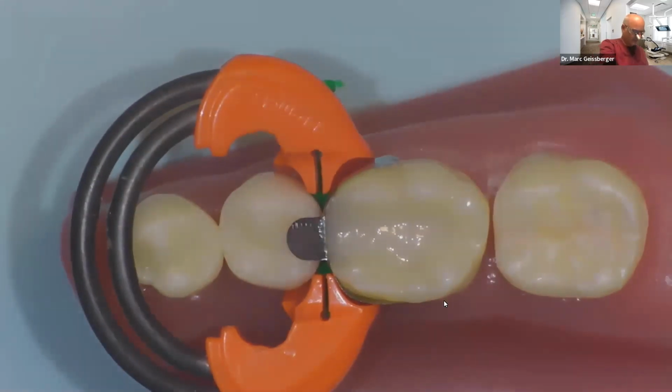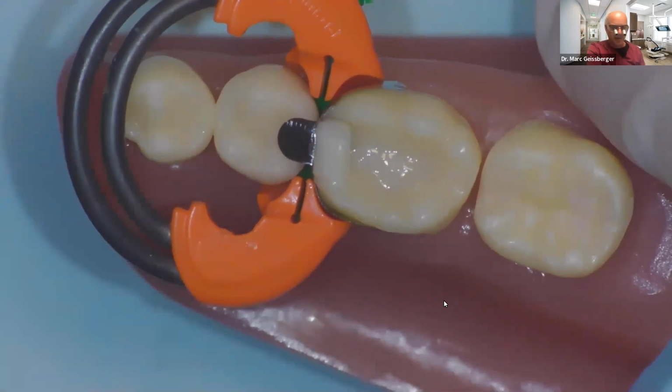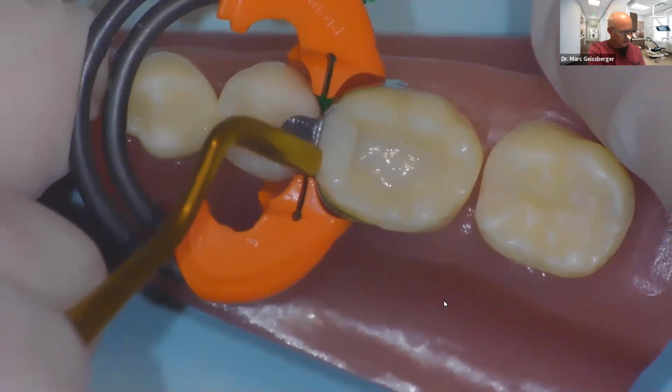Okay, now what I'm going to do is grab my composite, and I'm going to cut this final layer. And this box form was 6 millimeters deep. It was a deep one. I'm going to cut my final layer. And if you notice, I just laid that right in for the marginal ridge. I'm going to lay that in.